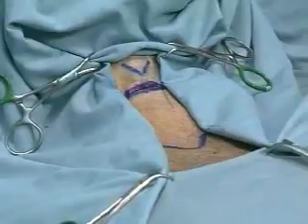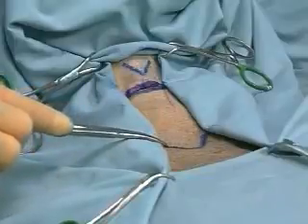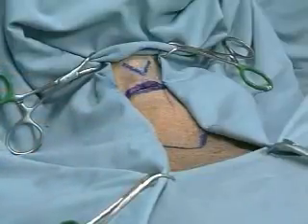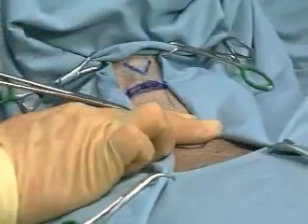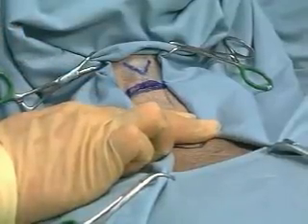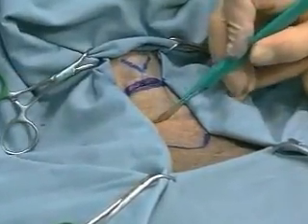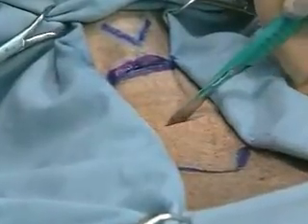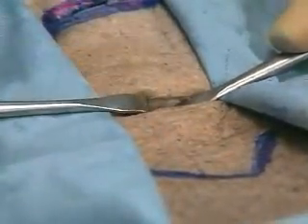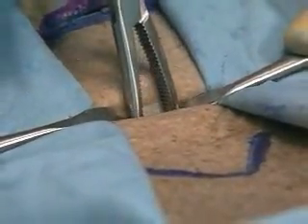Landmarks used for tracheotomy are the thyroid cartilage and the sternal notch. The incision is usually made approximately 2 finger breadths above the sternal notch. An incision of about 1 to 1.5 inches is made transversely. Strap muscles are separated vertically or transversely, and the tissue between them is divided.